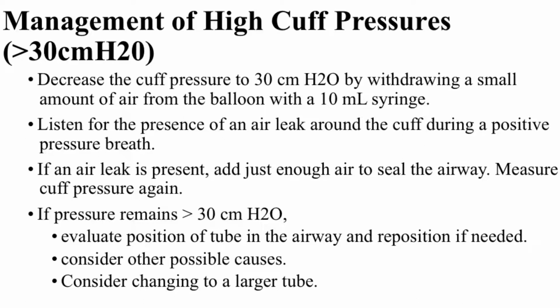If pressure remains greater than 30 centimeters of water, evaluate the position of the tube in the airway and reposition if needed. Consider other possible causes of high cuff pressures, or consider changing to a larger endotracheal tube.